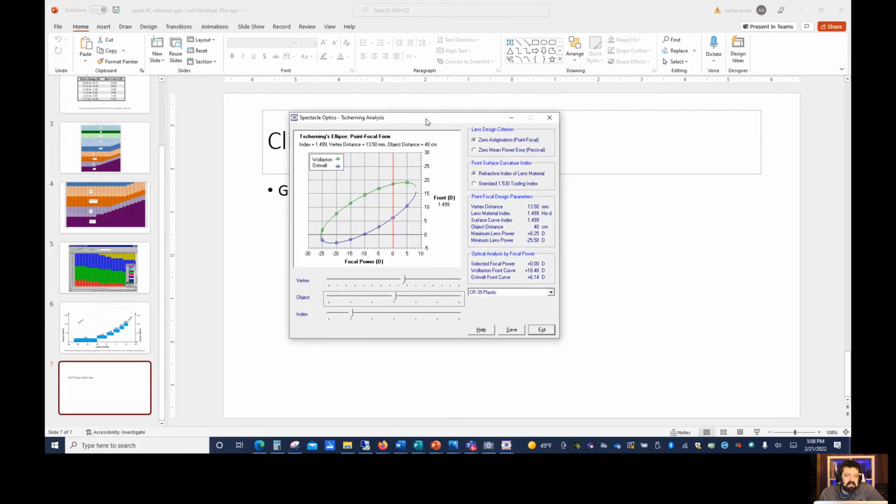And the purpose of this little exercise, without getting into specifics, is to show what the optimal Ostwald and Wollaston curves are based on, but there's a handful of variables. It turns out that we're going to use 13.75 for the vertex distance, because this is what the manuals for many of our phoropters say it is supposed to be set at when we're refracting. But if I change this based on how close or how far the lens is positioned, there's actually an argument to be made that how far away the lens is will alter what the ideal base curve will be.